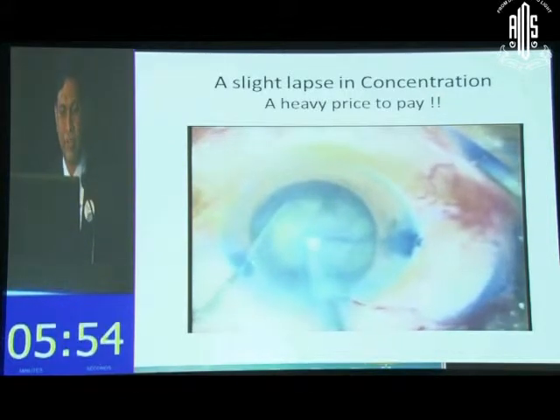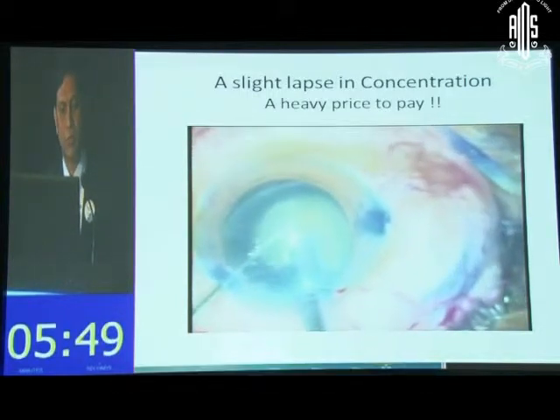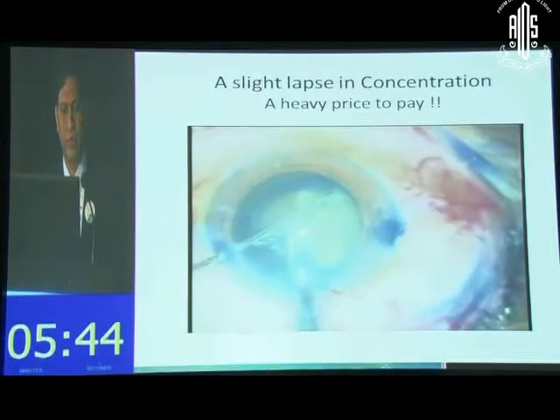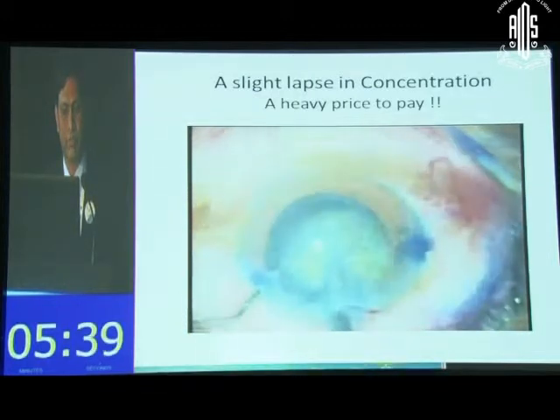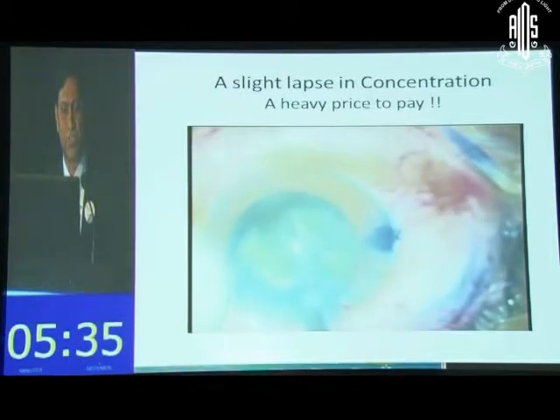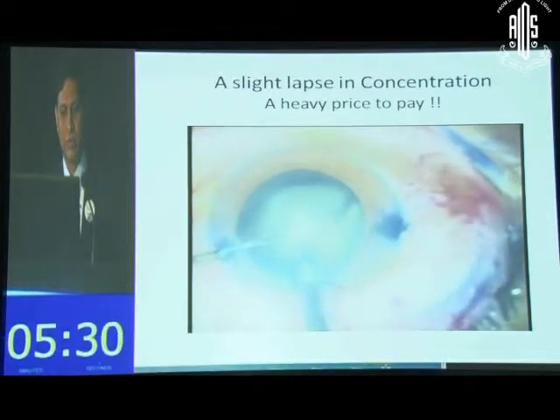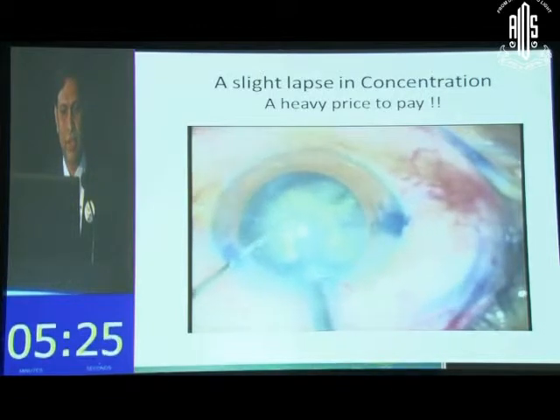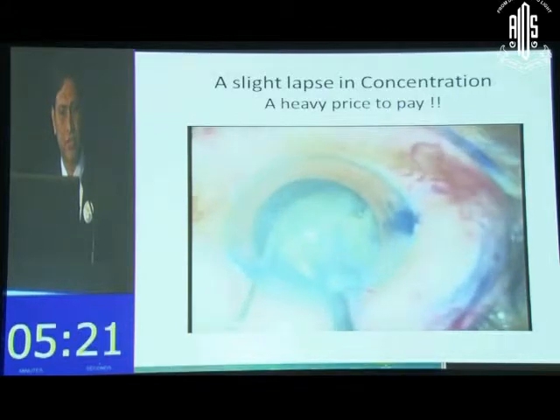Not that I'm a very experienced surgeon, but then I have spent a few years doing phaco, and this is what I'm doing. Watch that cornea. It's slowly turning pale white, and wait, that's not the end of the story. Wait till it gets chalky white. If you have not seen a bad wound burn, this is a good opportunity to see what you should not do. I would pray that none of you ever have to see a wound burn like this, because I regret this particular case all my life as to why I was not looking at the incision.